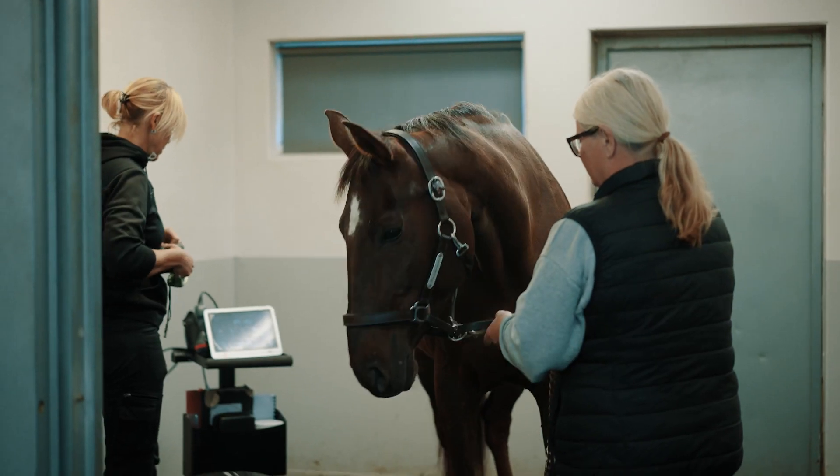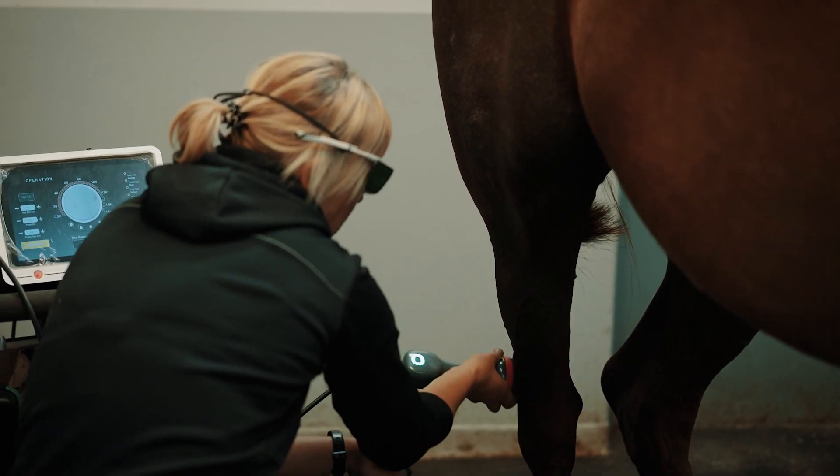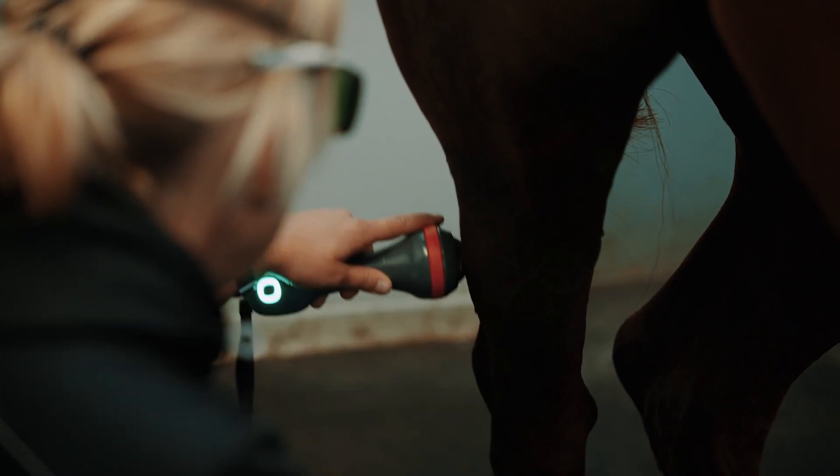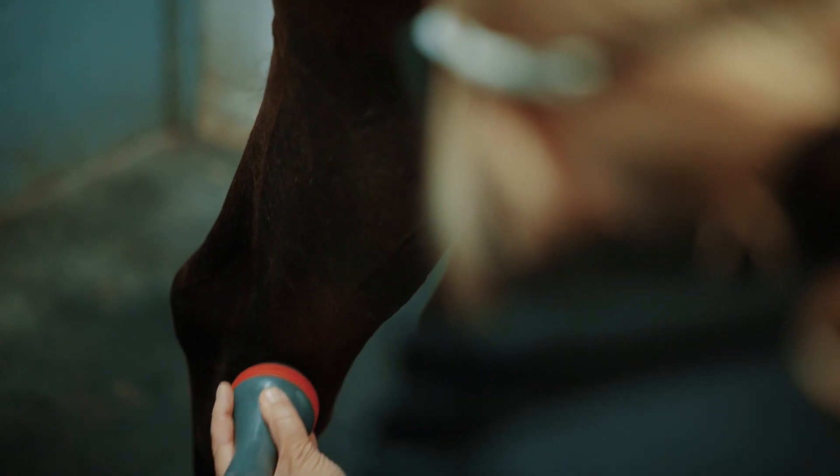Most often we use the laser when we have muscles that are sore or acutely injured and they need some relaxation. We also use it for acute tendon injuries with swelling and we see some great results. We also use it for acute and chronic wound management.